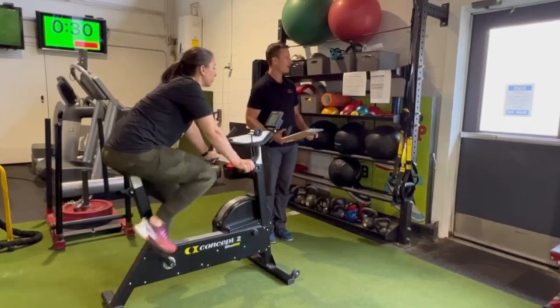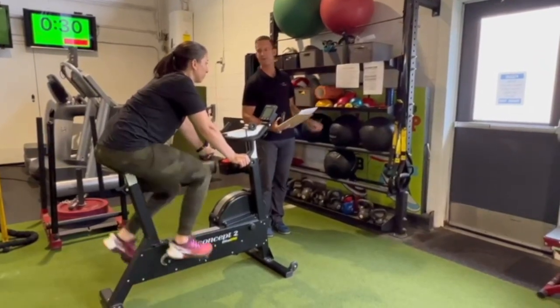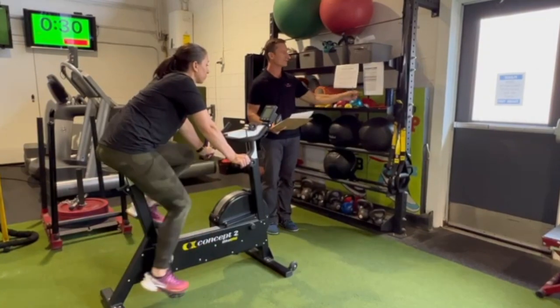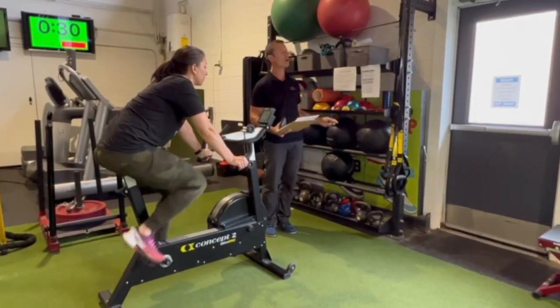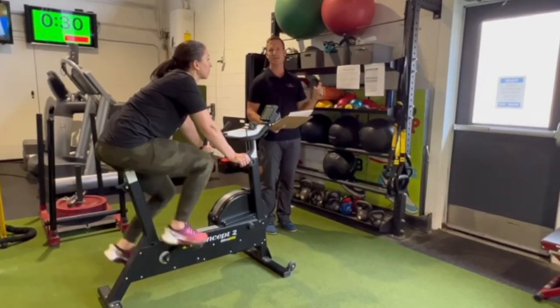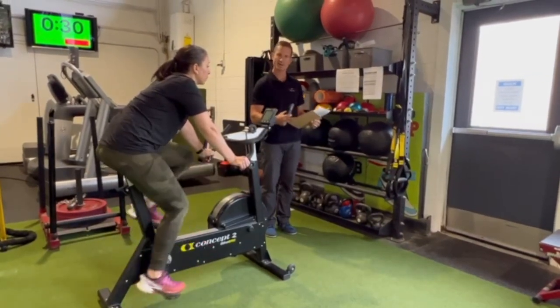An 8, and I know you don't have a concussion, but if you did, we'd ask you if anything's changed from this first to second interval. So we're going through this all the way to the end until either the rate of perceived exertion has gone higher than 18, or we've reached a stopping point and the symptoms have jumped more than 3 for any of her concussive symptoms. I've got her heart rate here. I've got my chart ready to document it all.